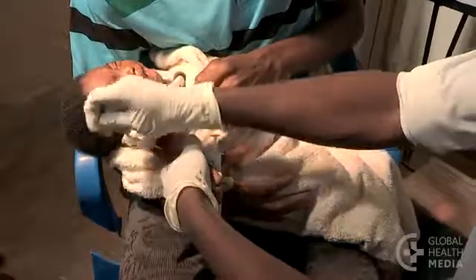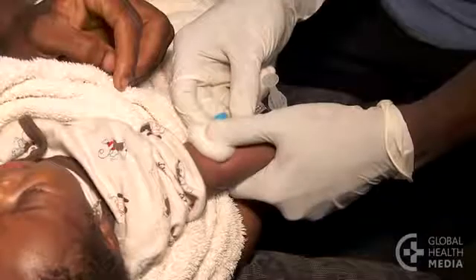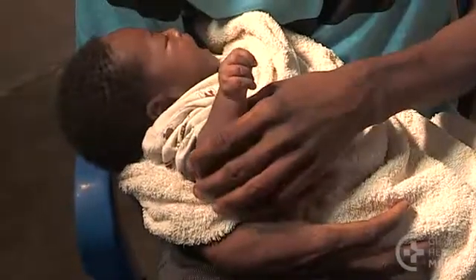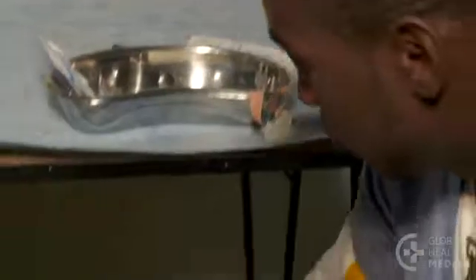Release the tourniquet. Remove the needle and cover the site with a cotton ball. Then safely dispose of the butterfly device.